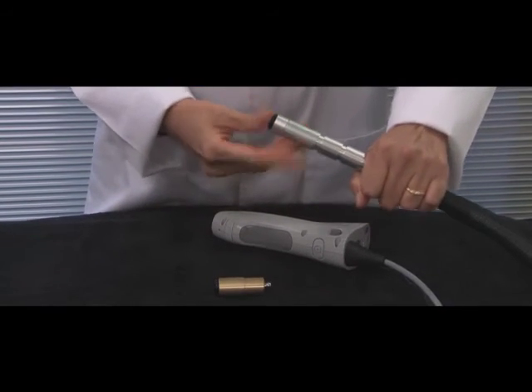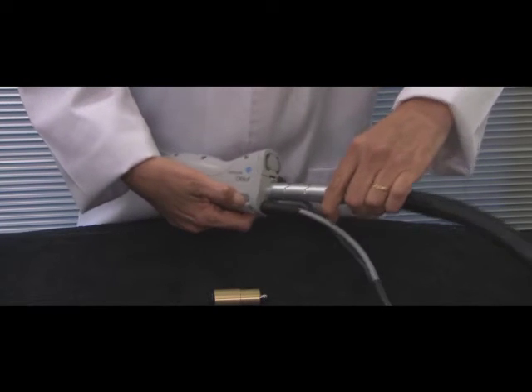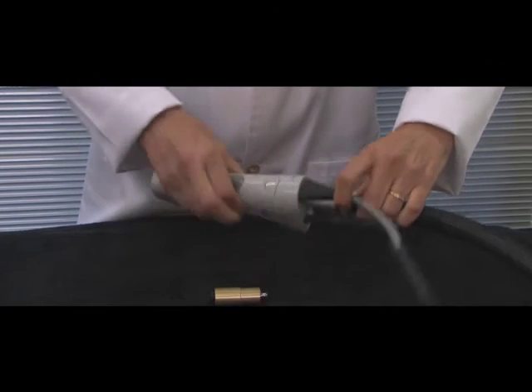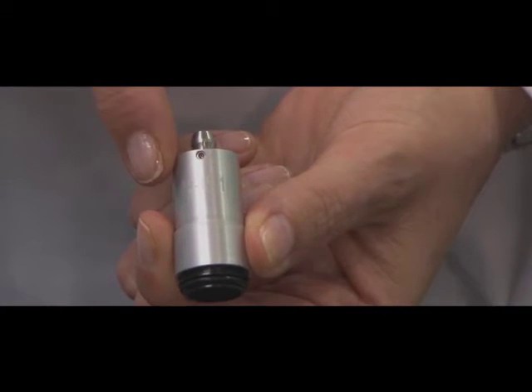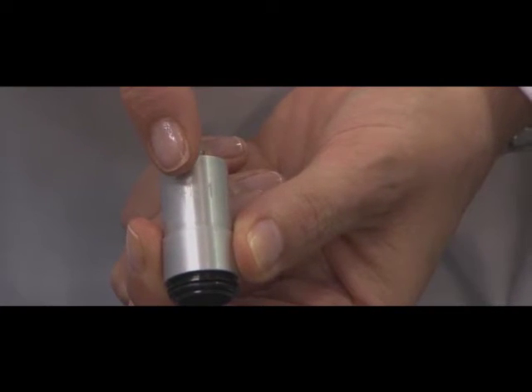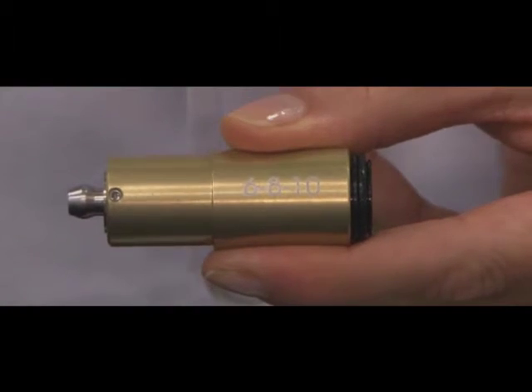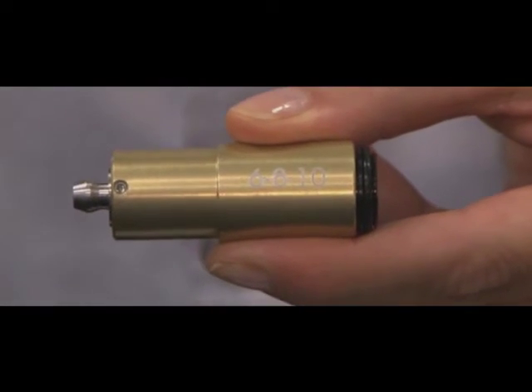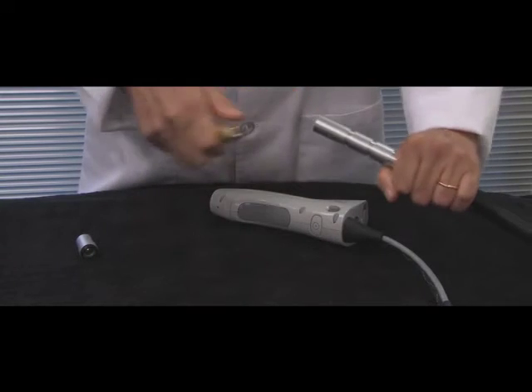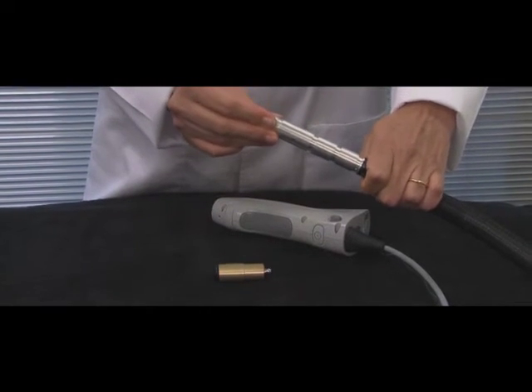To change the spot size, press the gray side button on the handpiece and move the slider until you have reached the desired size and feel the slider engage with a click. Notice that the silver piece called the slider attachment at the end of the slider is for spot sizes 12, 15, and 18 millimeters, and the gold for spot sizes 6, 8, and 10 millimeters. The piece is easily changed by pulling off the end and replacing it with the desired piece.